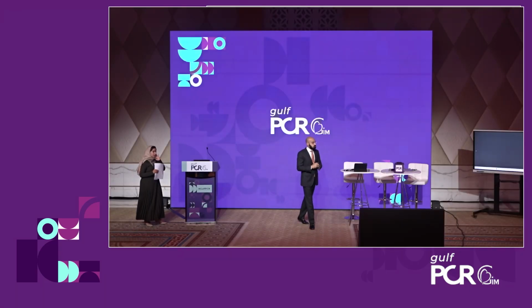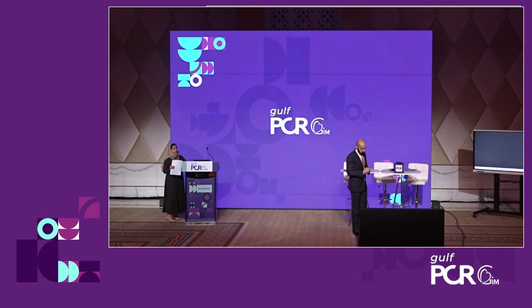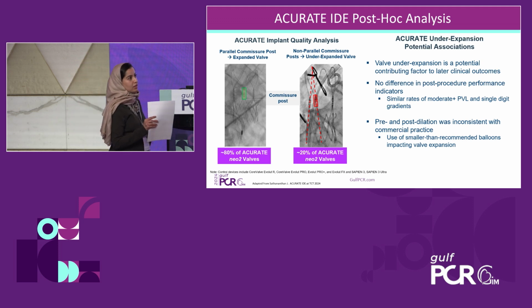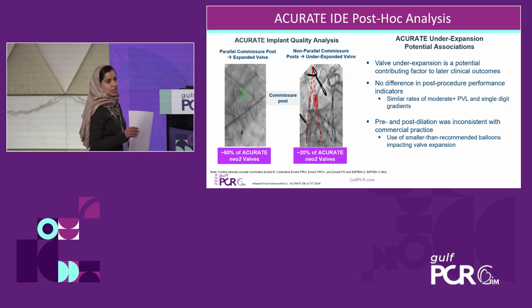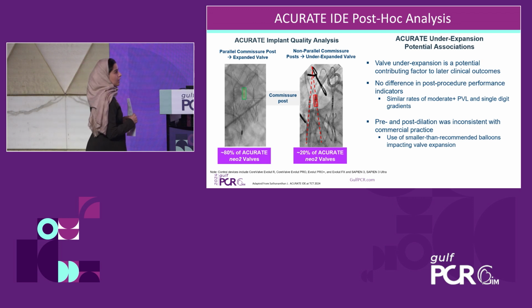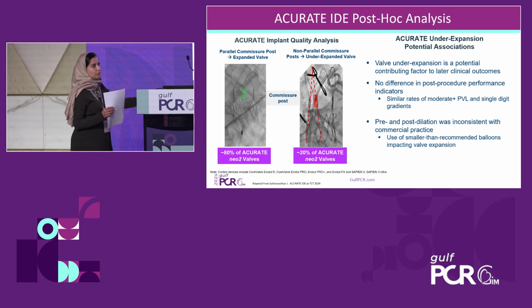Questions so far? We can have some of the slides up just to explain what has been done after the IDE. If you can project the slides, yeah, perfect. So basically we touched upon this already. Once you implant your device, you want to look at your posts, and they should be in a parallel fashion. You can see the image on the left, they're nicely separated. On the image on the right, the two are actually pointed towards each other. And this was found, as Hamid was mentioning, in 20% of the cases, so it's not low. It did not really translate into a higher gradient, but it probably was one of the reasons they had valve dysfunction, and probably resulted in some of these outcomes.